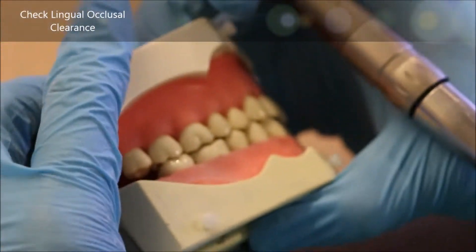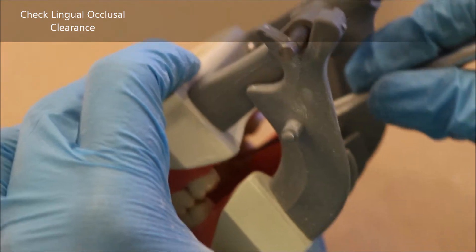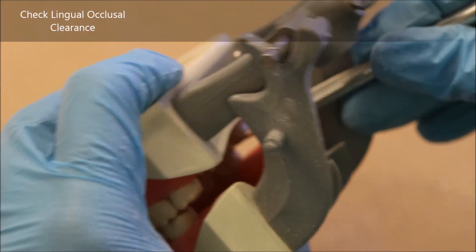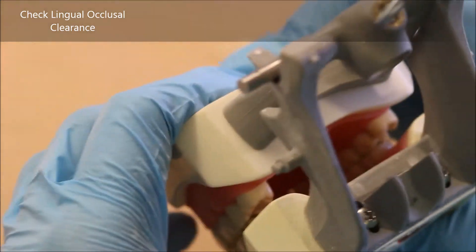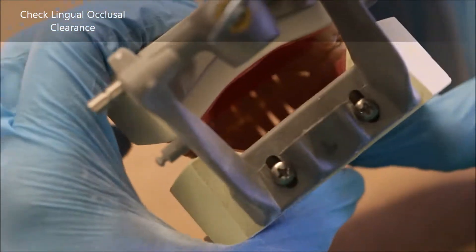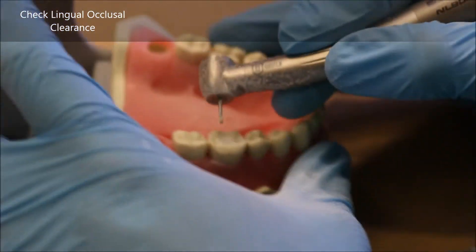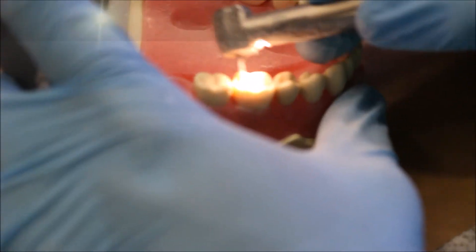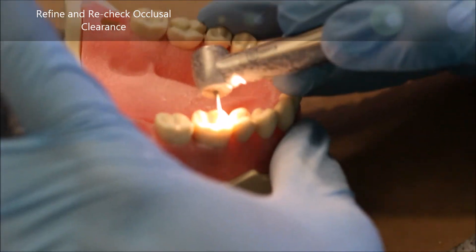Let's check again. Now I'm checking the lingual portion of the prep by closing my typodont and taking my RGS3 from where the patient's throat would be. I see that there are perhaps just a couple of areas in the lingual — like the cusp tips — where I need to touch it up a little more and make sure that I have the full one and a half millimeters.